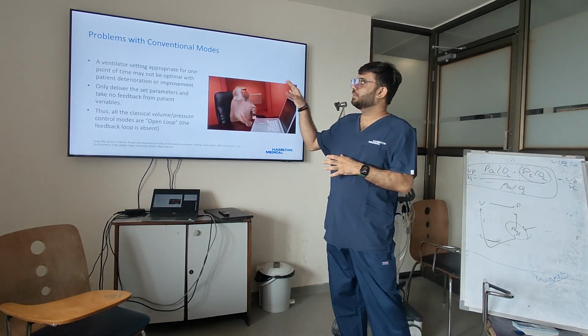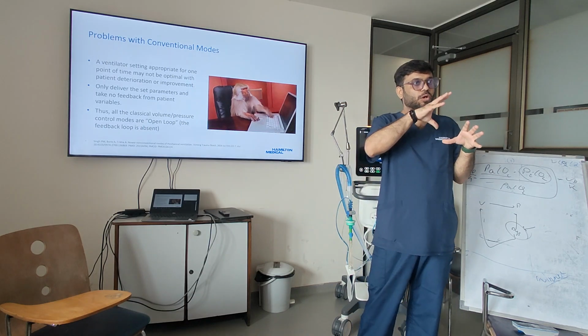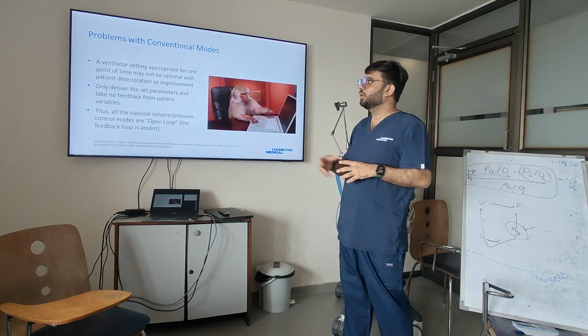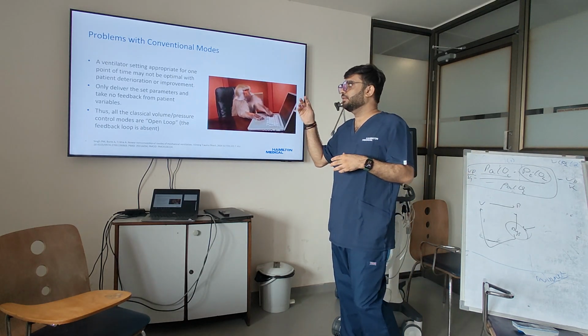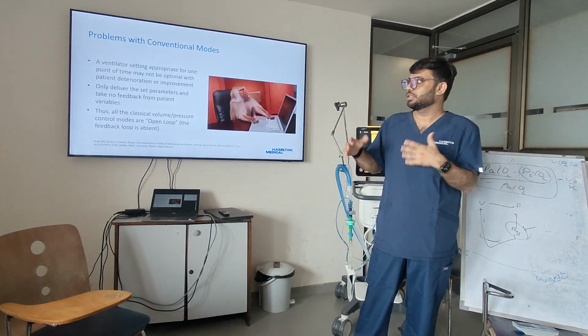So as we know, all the settings that you make will not be appropriate for all the time, and the ventilator only delivers the set parameters, which will not take any feedback from the patient side and change the variables.